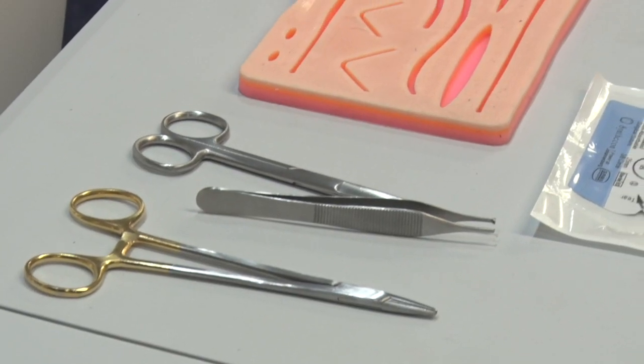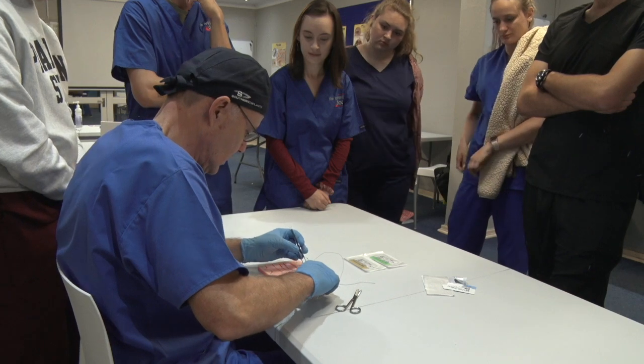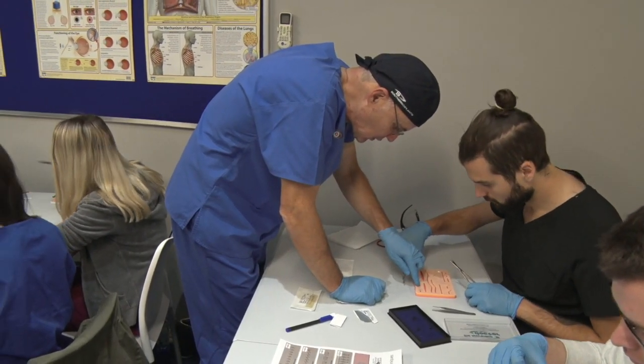Students prepare the simulation skins for practicing suturing skills. The instructor will first demonstrate the various suturing techniques to the students. The common suturing techniques are demonstrated in a fair amount of detail, and then students get time to practice.